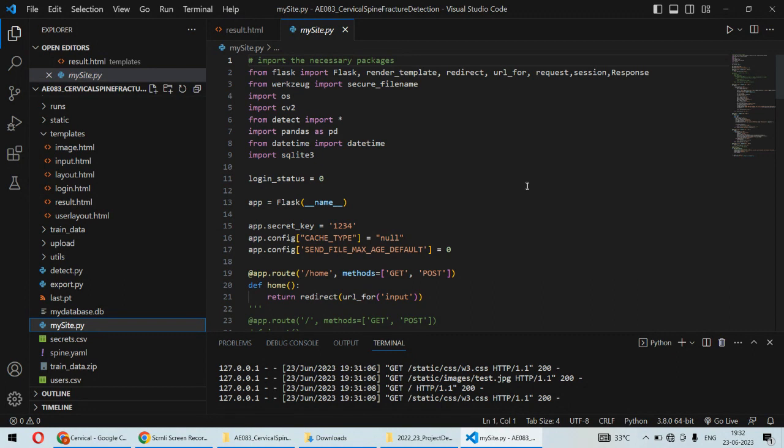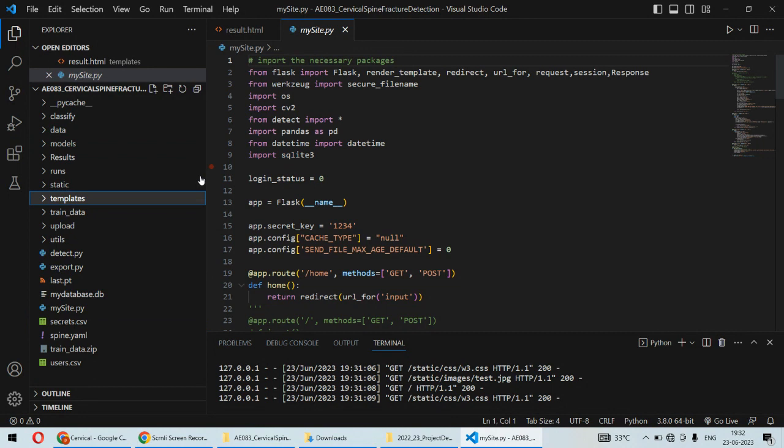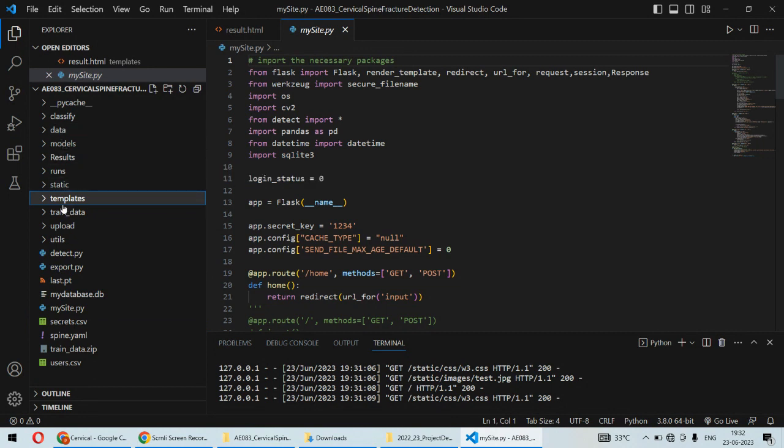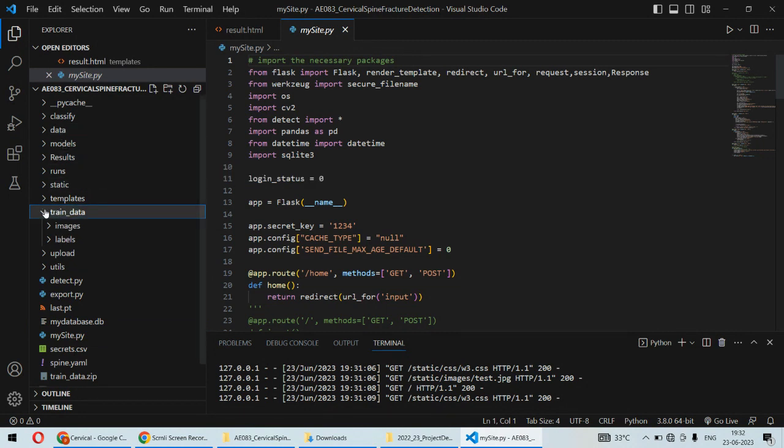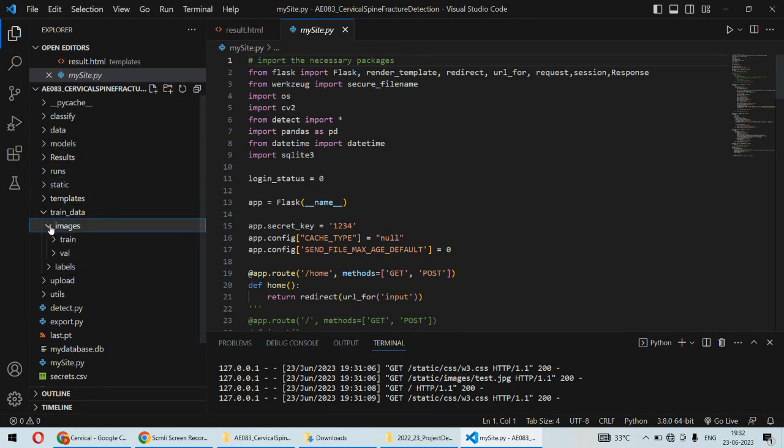Now we are having a dataset and we train the YOLO object detection model on this dataset. We are having so many images of the fracture and we have trained the model on that dataset.